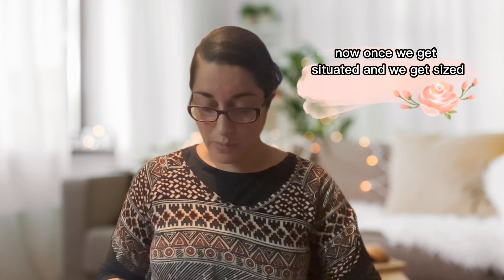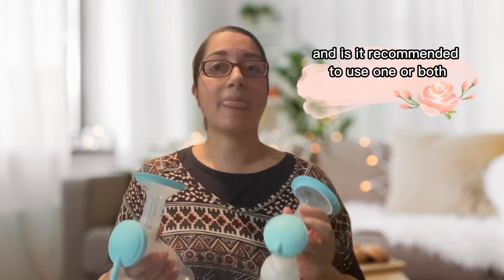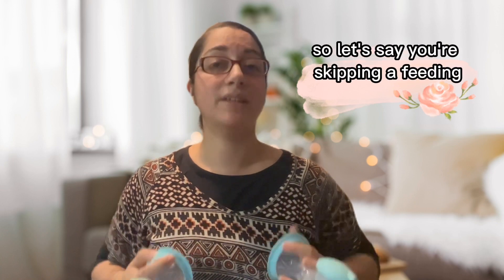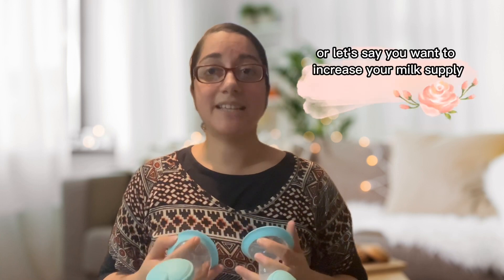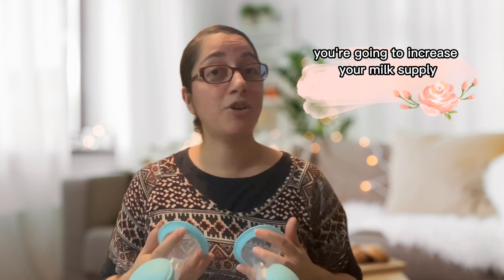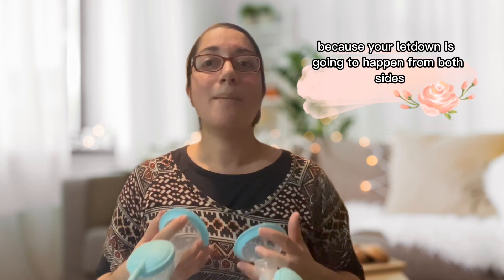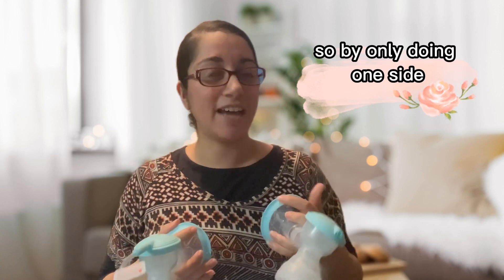Once we get sized, how do you use the breast pump? It is recommended to use both sides at the same time, especially if you are skipping a feeding — say you're at work, or you want to increase your milk supply. You're going to increase your milk supply because your letdown is going to happen from both sides. By only doing one side, you are skipping out on a lot of good milk supply.